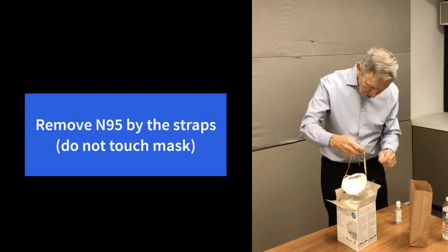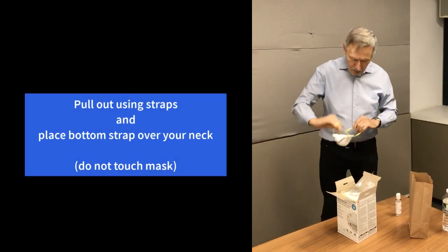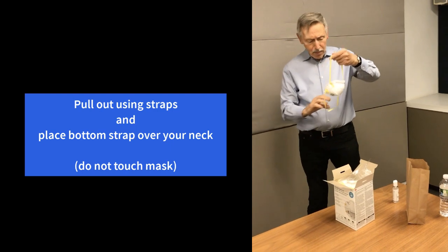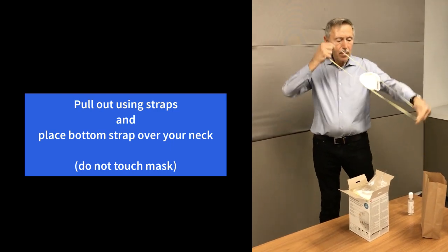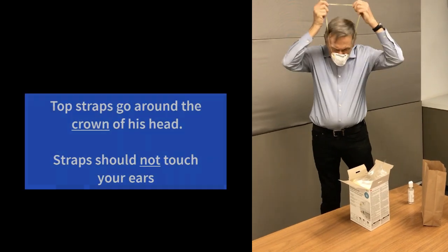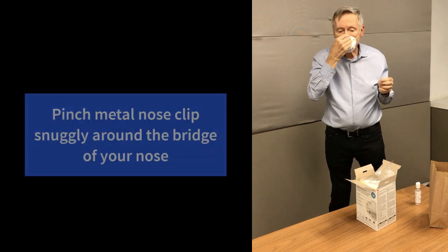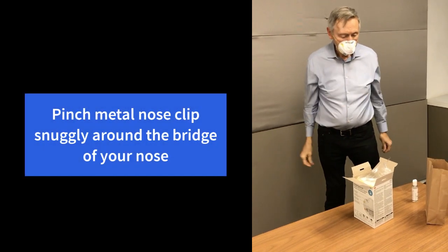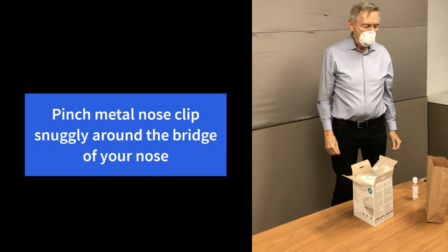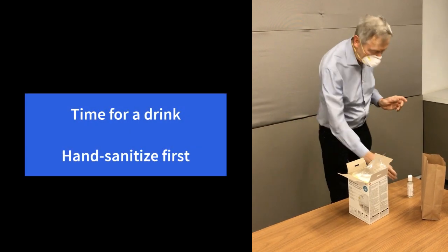Reach in and grab it by the straps, and you'll notice what he's going to do is stretch it and put the bottom strap over his head to his neck and proceed to put the cup into his chin and the top straps around the crown of his head. Next, notice how he squeezed the metal clip to make sure he's got a good fit.